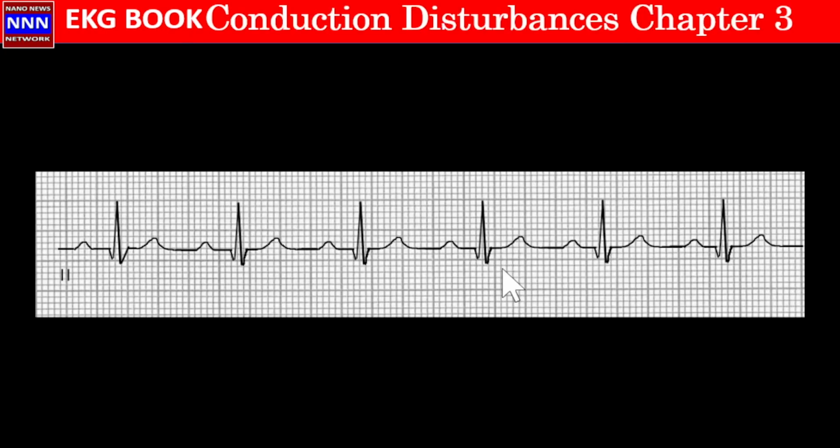Okay, let us proceed. Here is an example of an electrocardiogram strip. What is your diagnosis before we proceed any further? When you are looking at these tracings, you need to look at the morphology of the P waves, the PP intervals, the QRS morphology, the relationship between P and QRS complexes, and if the rhythms are regular or irregular, and if they are irregular, do they have a particular pattern?